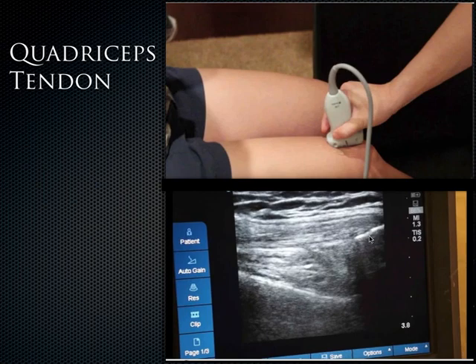He initially said this was the femur here. That's actually the tibia. Slight error I just noticed. So in the beginning of this video. And I'm sorry, no, I just made a mistake too. This is not the tibia. This is actually what? The patella. Okay? So femur, patella, and this is that quadriceps tendon coming across here.